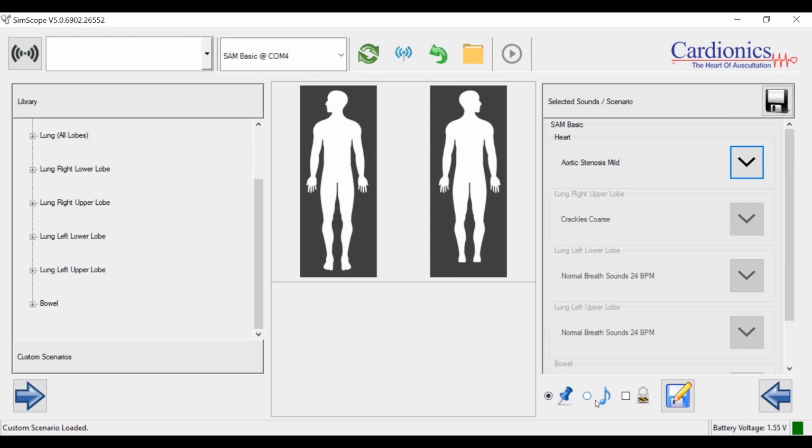And then we also have the second one, that is play sound by file. So here, from the drop-down list, you select the particular files that you have uploaded. You can also play them through there.